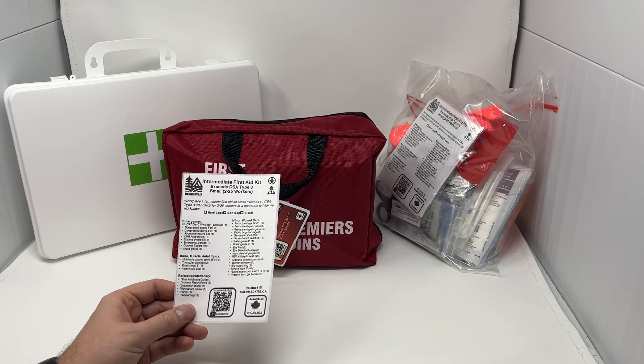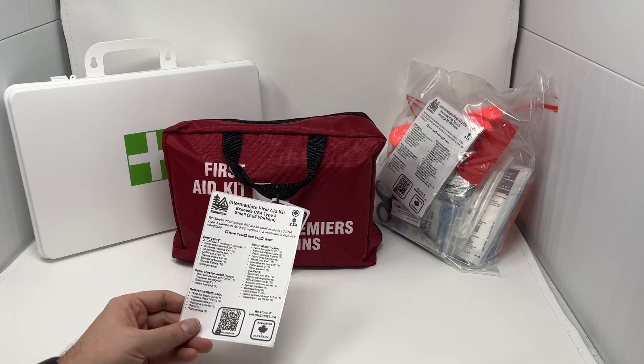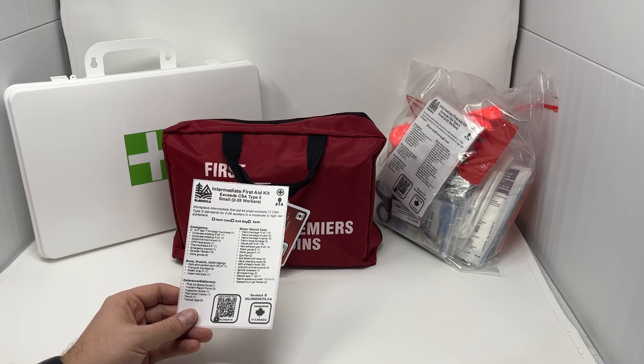These kits all cover up to 25 employees each. So if you have more employees than that, you can purchase multiple kits and stage them throughout your workplace where it makes sense.